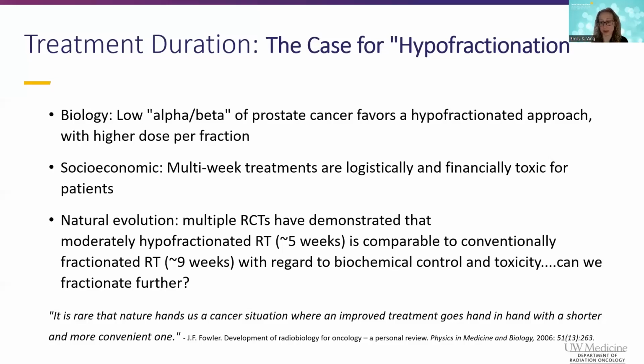And that means we're able to condense treatments that used to take 8 or 9 weeks to 4 to 5 weeks. And we can do that because we have also developed the technology to do that safely, including all the things that we've reviewed that go into radiation planning, interventions that make sure that your daily setup is spot on, interventions that make the radiation more pinpointed and carefully shaped so that we can send these higher doses into the prostate and feel confident that it will be well tolerated. So that's the sort of biological rationale for hypofractionation.